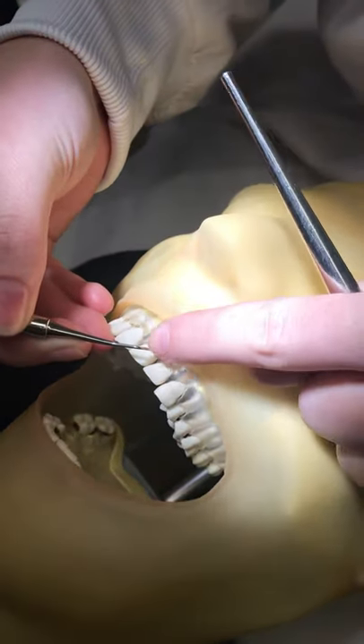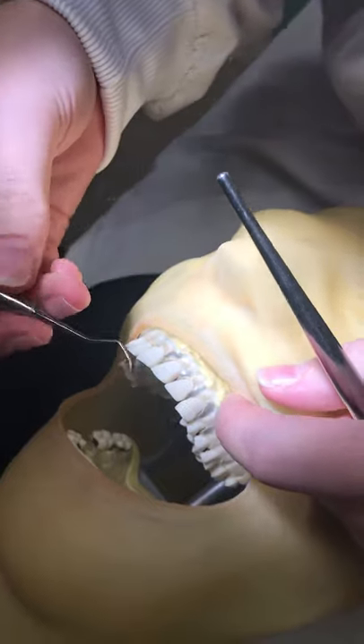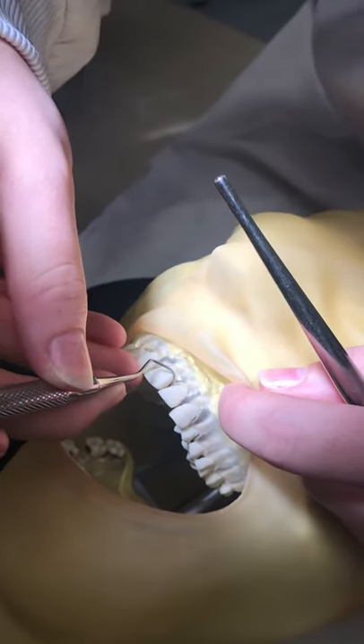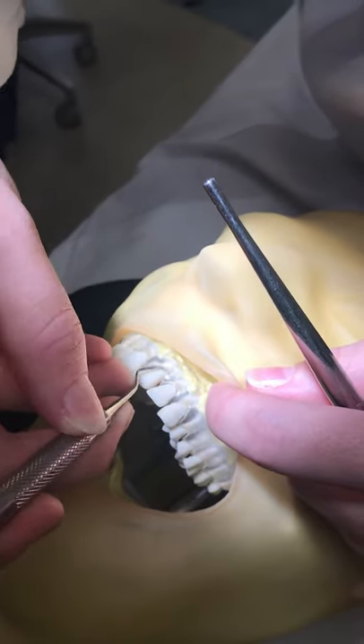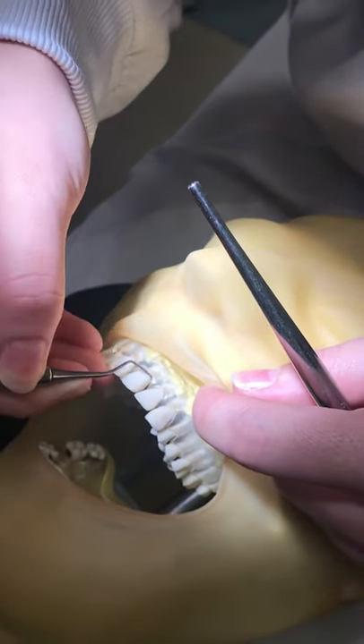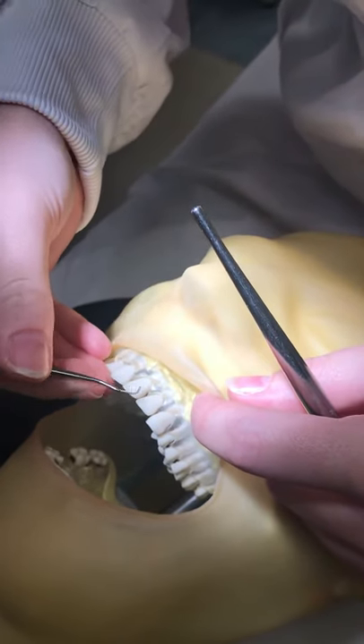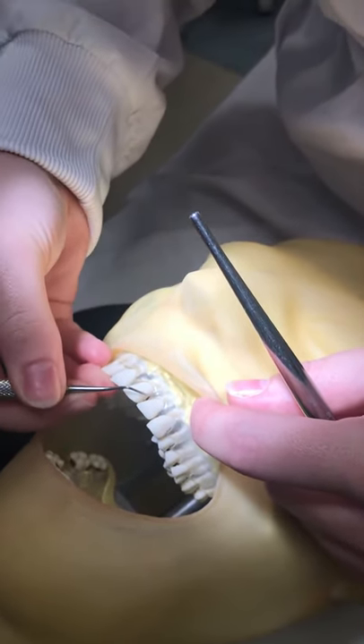You're going to want the shank to come across like so. You're going to start at the distal line angle, insert, and then just go for it. And then when you come around, insert.